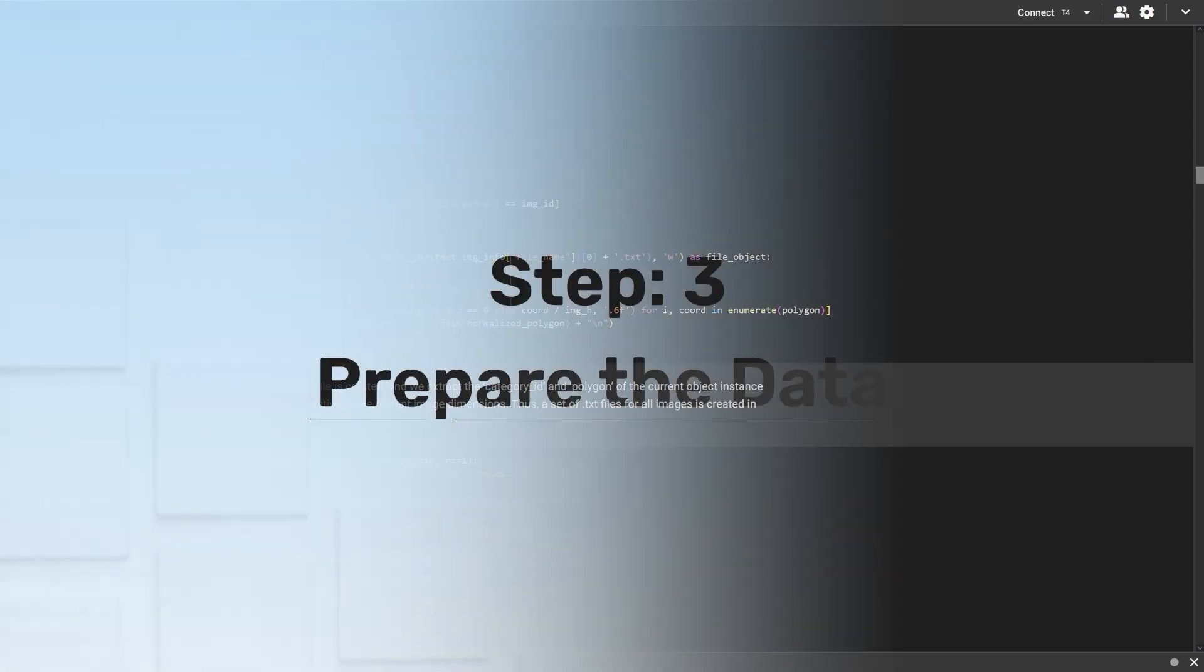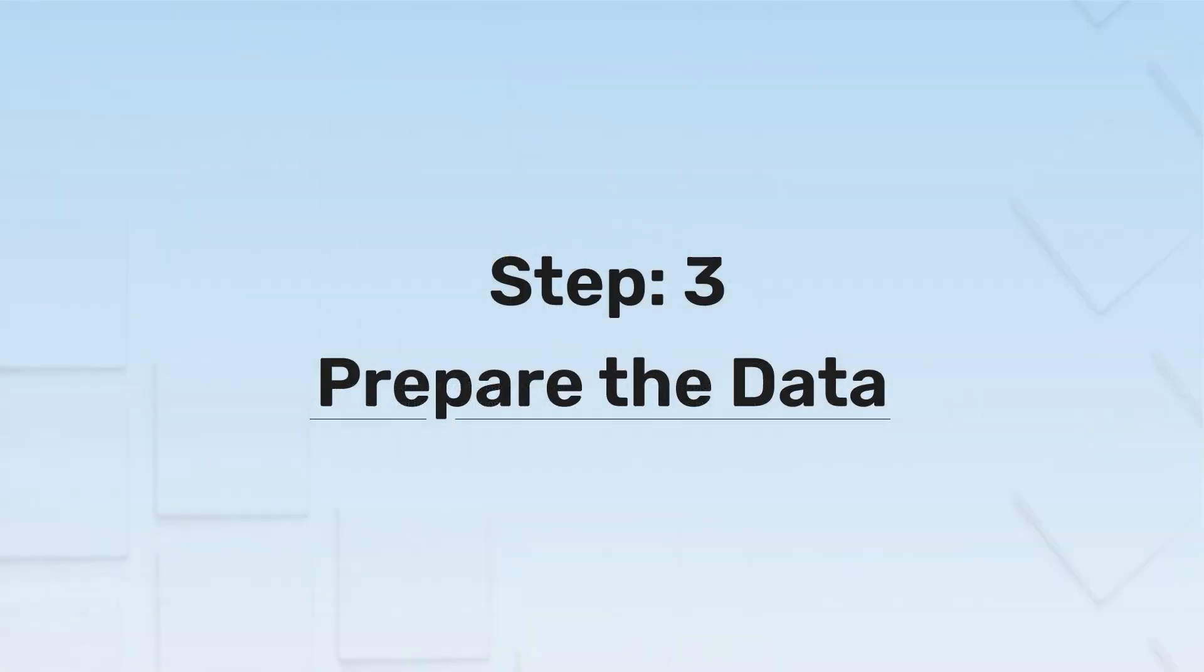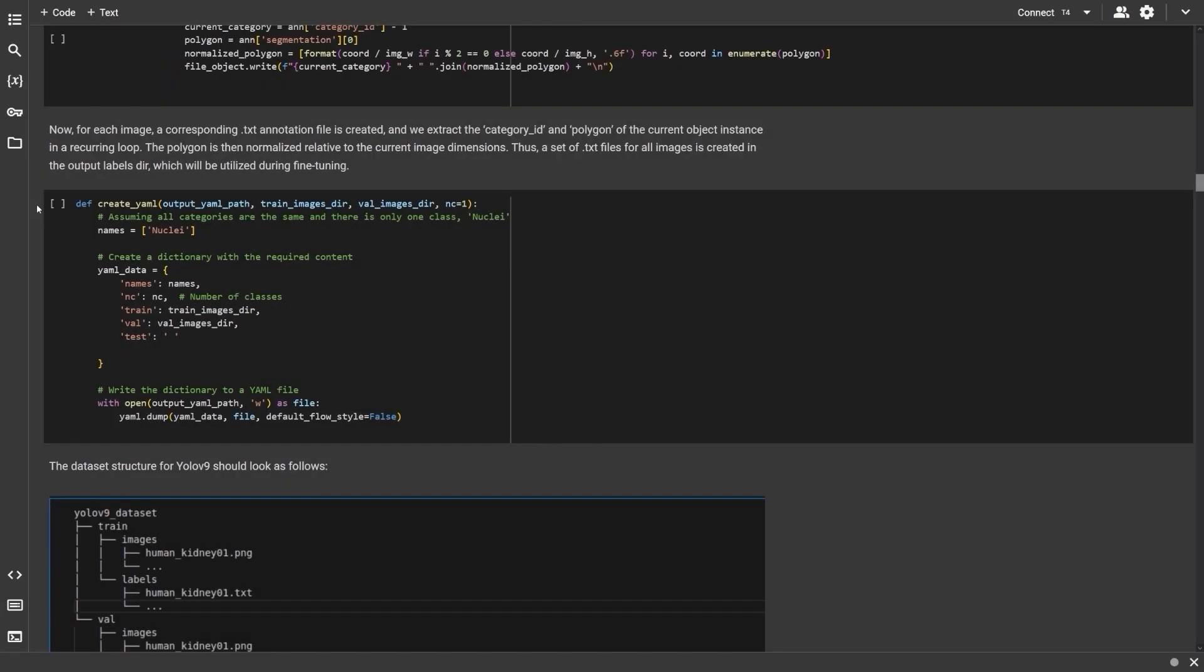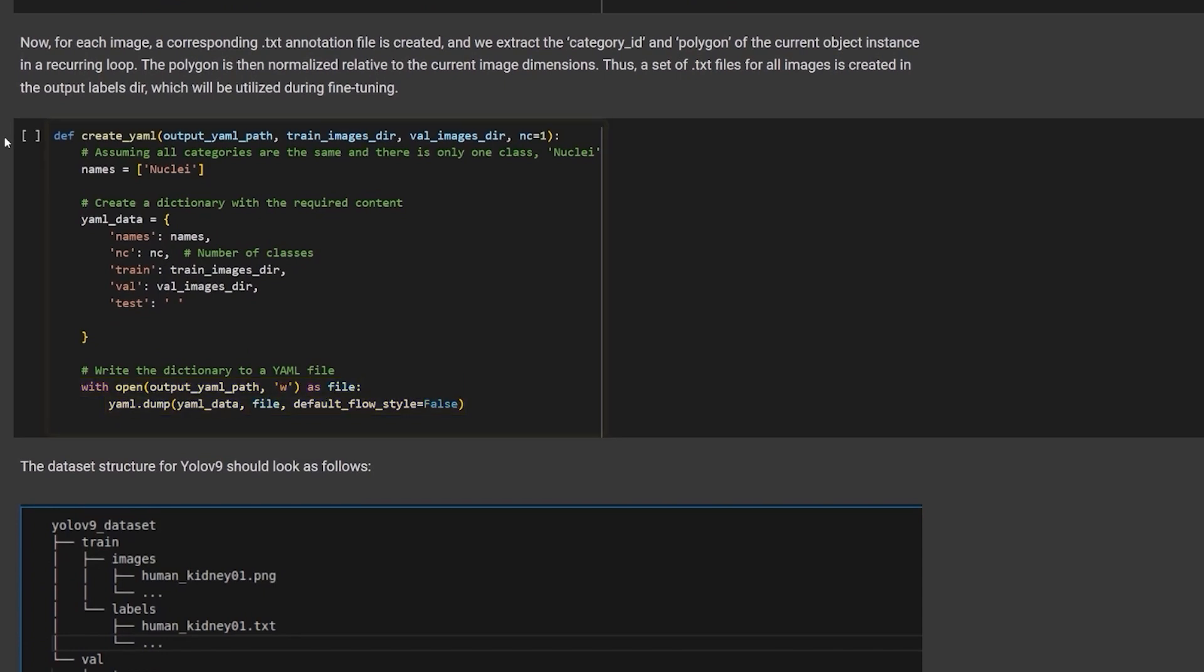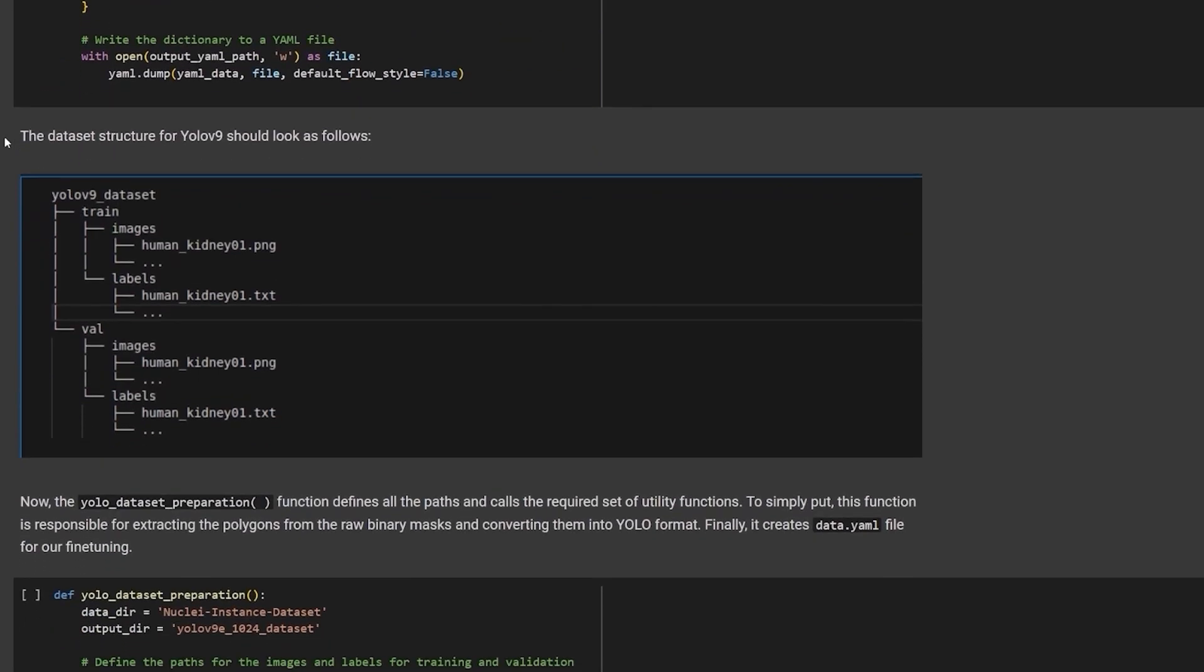Step 3. Prepare the data. Now, to train the model, we will need to provide a YAML file with the dataset config. The createYAML function will input all the dataset paths and write the YAML file. At the end of this process, this should be our directory structure.